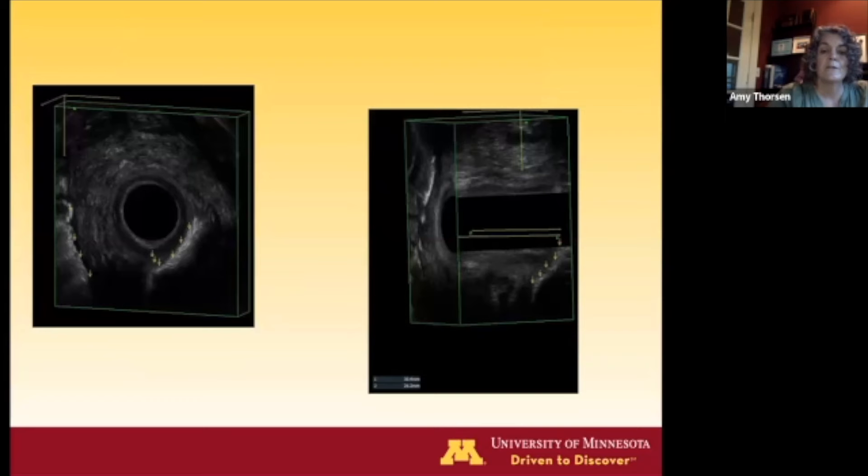For a patient with a complex fistula, we inject hydrogen peroxide into the external opening. The bubbles show up bright white on ultrasound. This patient has an internal horseshoe in the intersphincteric groove on the left side, and also a horseshoe outside the sphincter complex. On the sagittal view, you can see where a posterior midline fistula comes through. You can measure how high it is above the intersphincteric groove and above the anal verge, providing planning and counseling information.